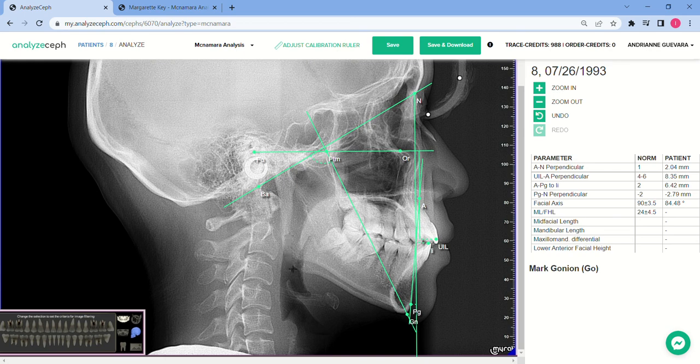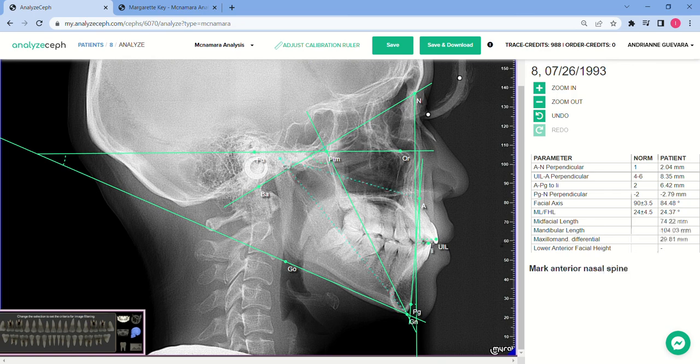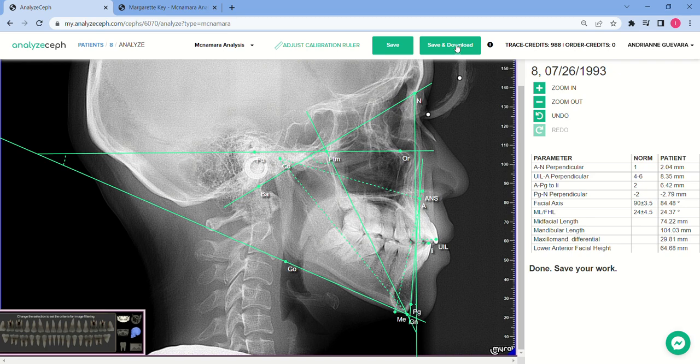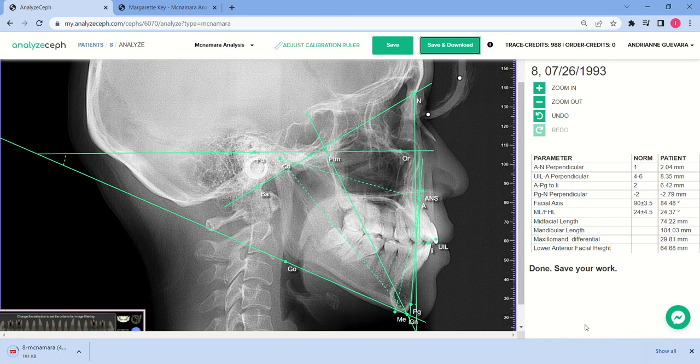Mark gonion. Mark condylion. Mark anterior nasal spine. Mark menton. Once you're done, Analyzef automatically tells you that you're done. We're choosing save and download, so you'll be able to get a PDF copy of your analysis.